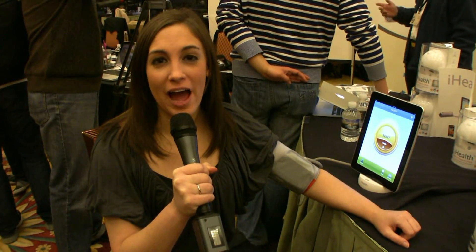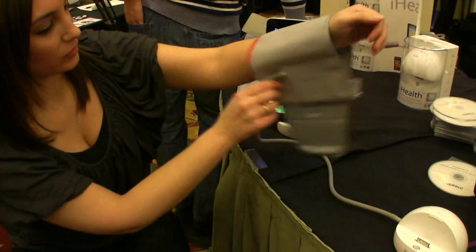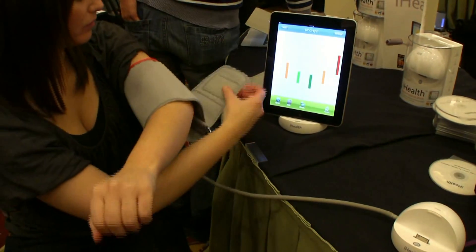This is Kelly Clay from LockerNome, and I am testing out the iHealth. The iHealth blood pressure dock is the first ever blood pressure dock that you can use with your iPad, iPod, or iPod Touch.